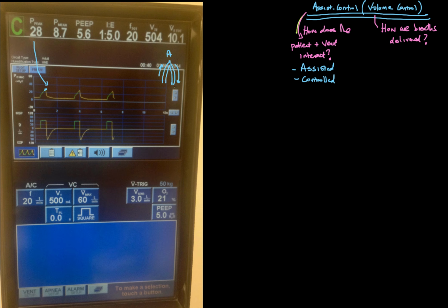Okay, so back at the ventilator over here, the ventilator measures in this area, it measures the volume coming back into the ventilator. So this is why this is tidal volume, V subscript T with little e. It's expired. Okay, so this is our inspiratory, blow it into the patient, and then the patient exhales it back out. So it's measured on the expiratory side.